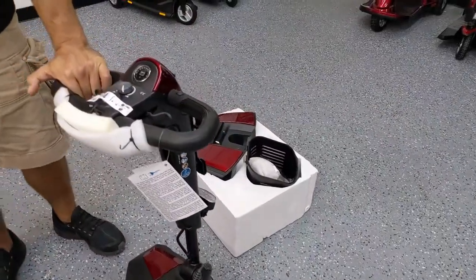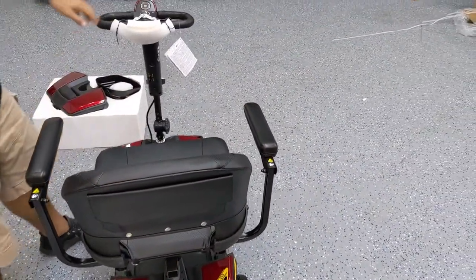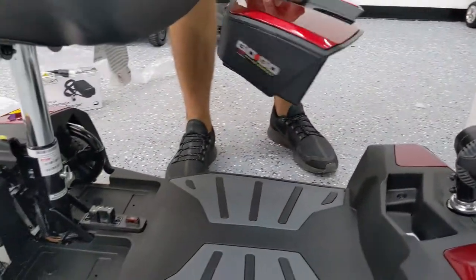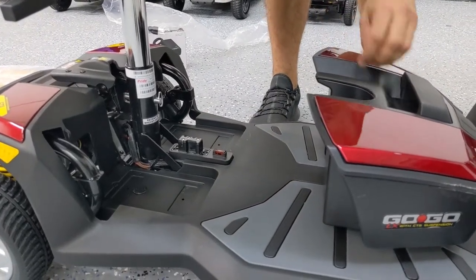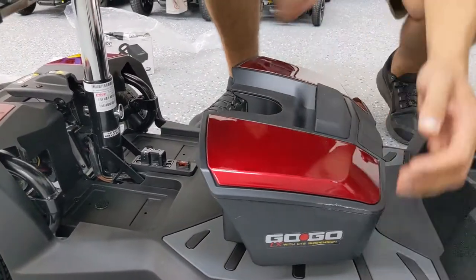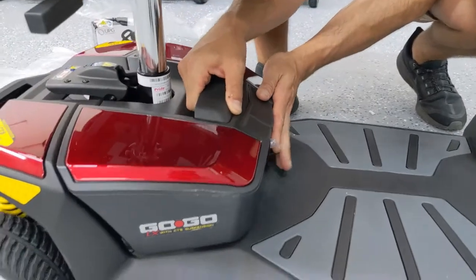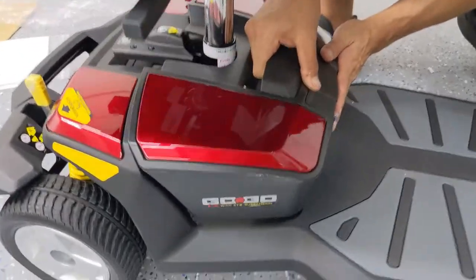At this point, we have the flip-up armrests — both of them adjustable and removable. The only thing we really have left to do is attach the battery, which is a battery box. Inside this box we have two 12-volt sealed lead-acid non-lithium batteries. To put the battery box in, just make sure it's level — you don't want to put it in tilted forward or back. Perfectly level, and it should drop right in. Push it back and it sits right in there. To take it out, you do the same thing — just pick up and drop it right in.